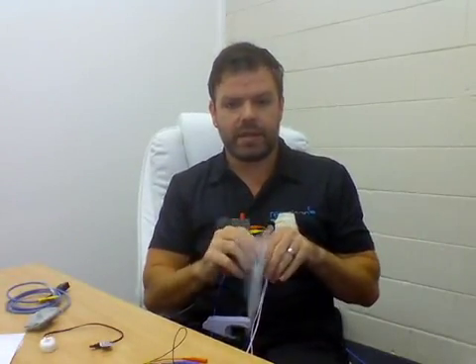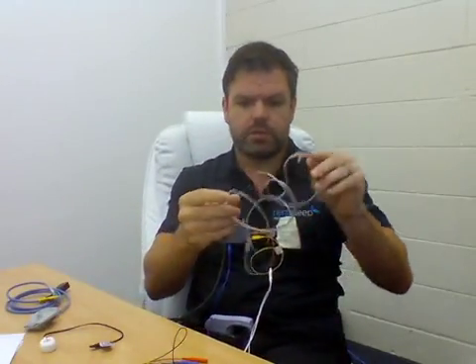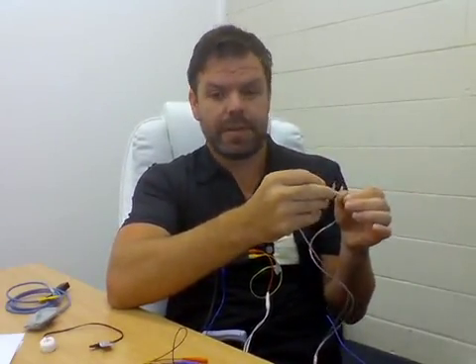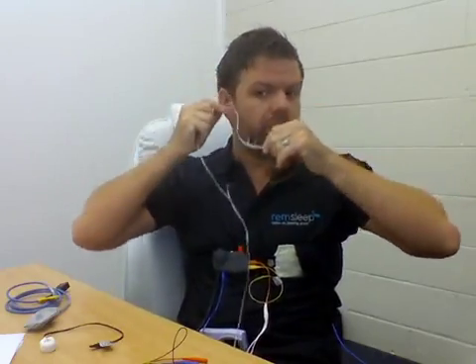I'm just going to pause this for 1 second while I grab something. Okay, next step is the nasal cannula, which looks like this. They normally give oxygen through them in the hospitals, but this will measure our flow, our breathing, and it'll also tell us about snoring as well. It's got a little bit of a shape, and you want it coming towards you, like this, and you go straight up in the nose, up over the top of one ear, up over the other ear, and then you tighten at the bottom.